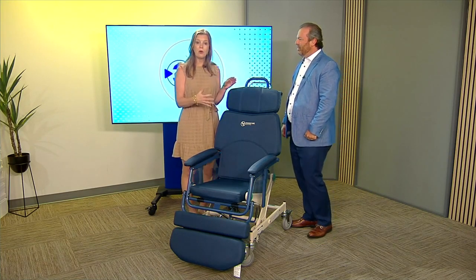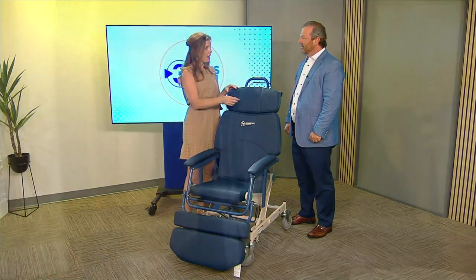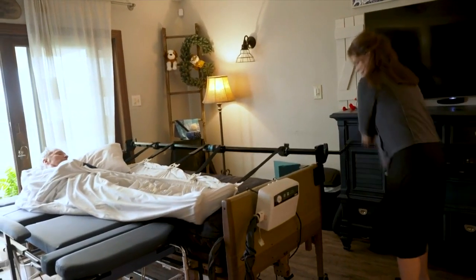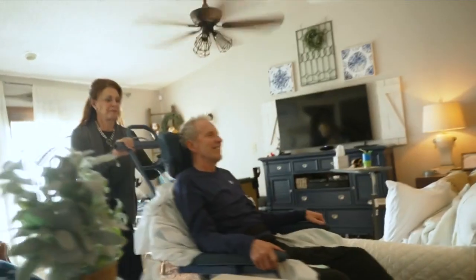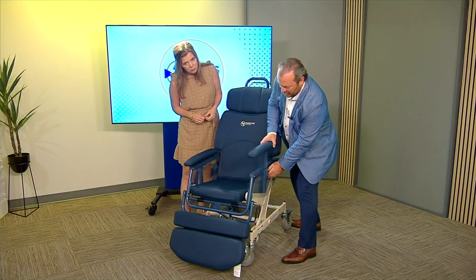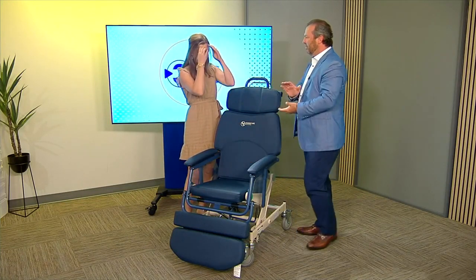Safety is definitely part of it. So we aren't going to show you all of this live on television. You can see the video that we have, but there are straps that are put in place to keep the person from sliding, correct? That's right. In the initial move. You'll see the mechanism, the armrest elevate to prevent the person from sliding. And the footrests lower down to give them a place to rest their feet.